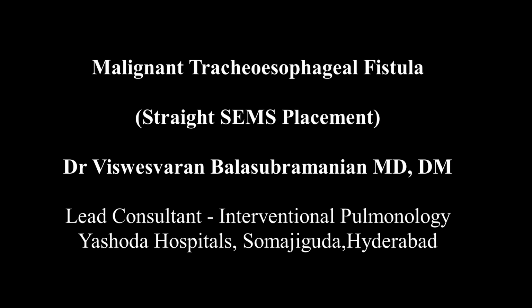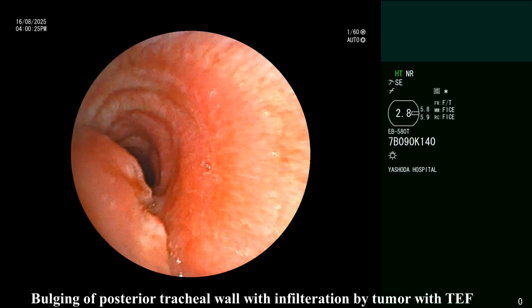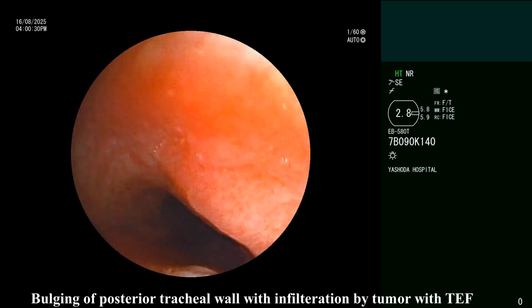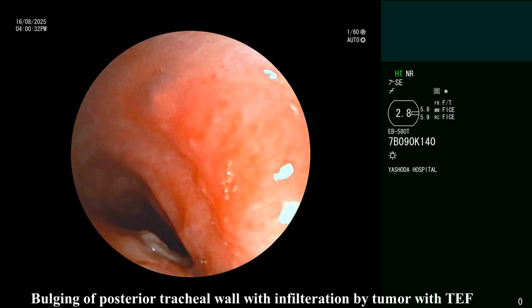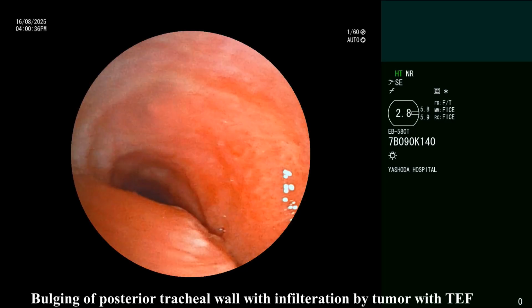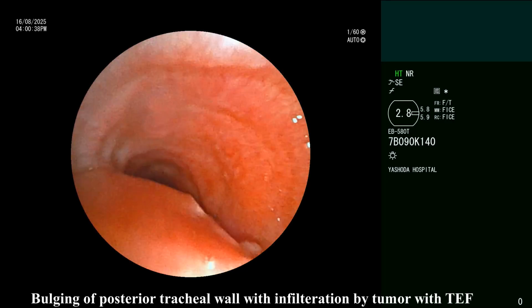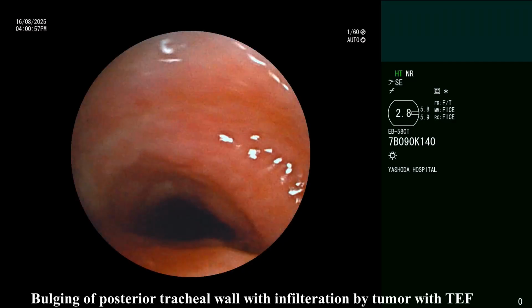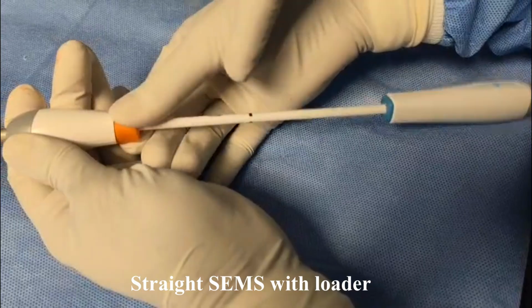Hello friends, today we will see about straight self-expanding metallic stent placement for a patient with a malignant tracheoesophageal fistula. As you can see from the video bronchoscopy here, there is a presence of bulging of the posterior tracheal wall with the infiltration of the tracheal wall by the tumor with a malignant tracheoesophageal fistula. Now we are planning to close this with the help of a self-expanding metallic stent.